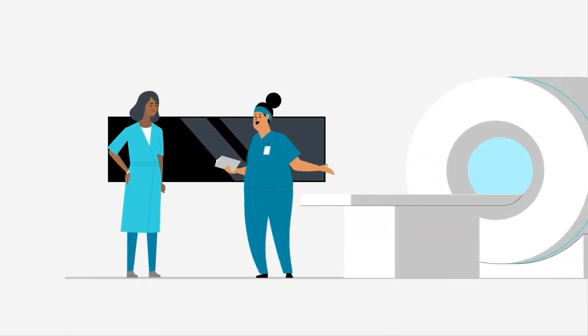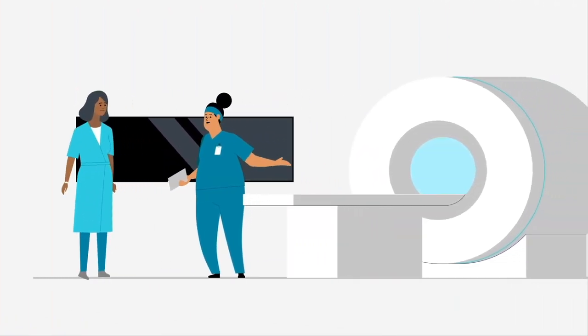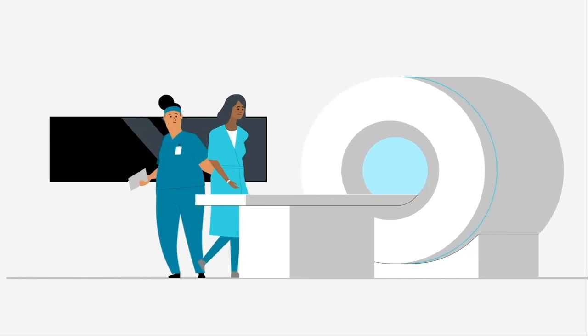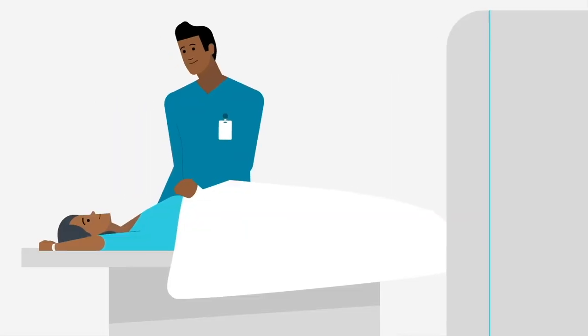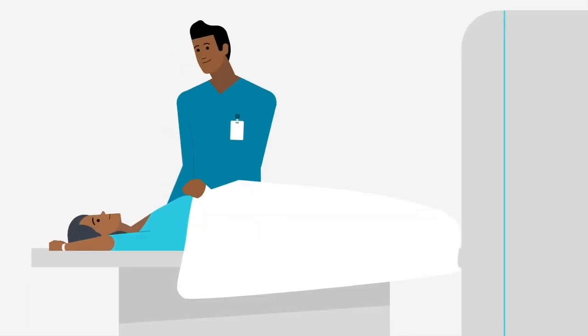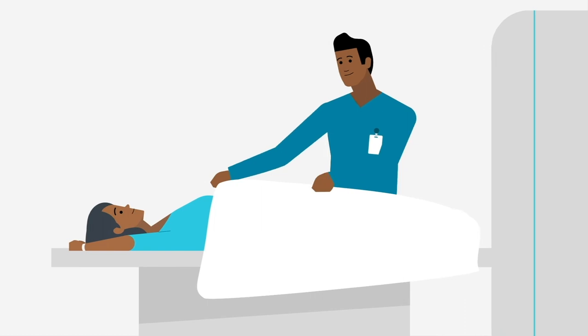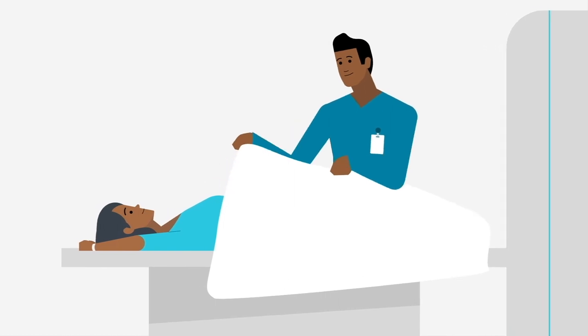When it is time for your test, a technologist will bring you into the exam room and position you on the table. The position depends on the type of exam you're having. Technologists are specially trained to guide you through your exam.